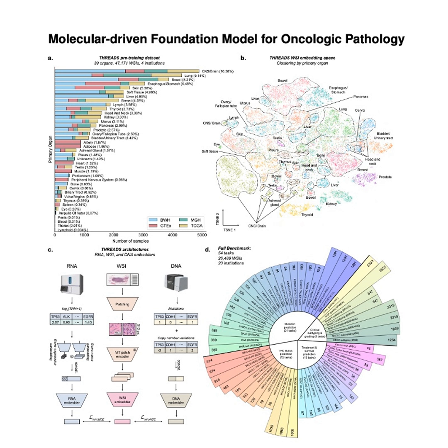It significantly outperformed baseline models in identifying similar cancer subtypes in their tests. Helping with diagnosis confirmation, or maybe even suggesting potential treatment avenues based on similar past cases. Exactly. Aids diagnostic comparison, treatment planning, education, lots of potential utility there, just using the embeddings directly.